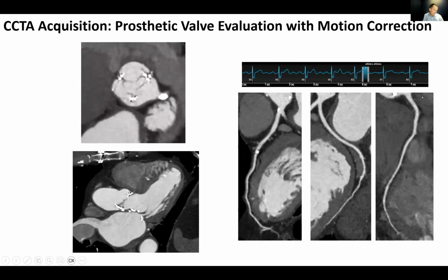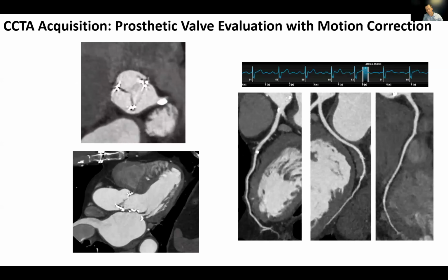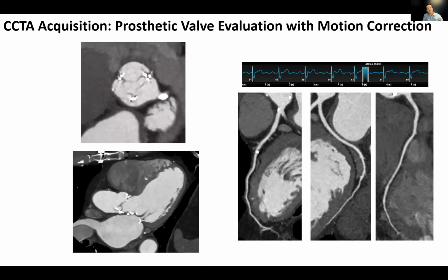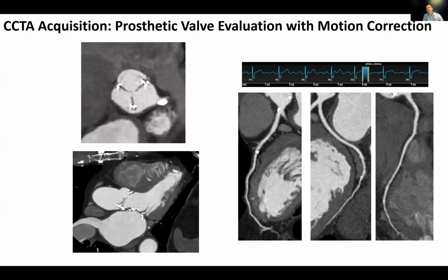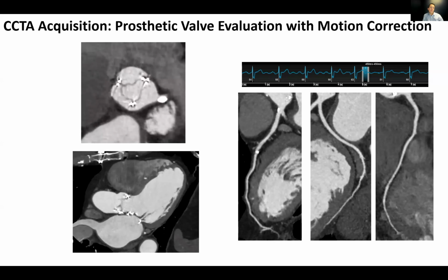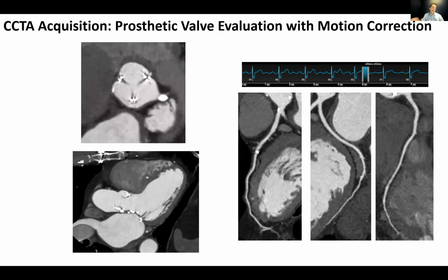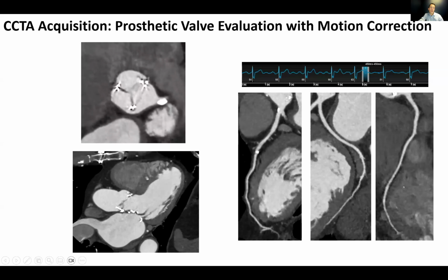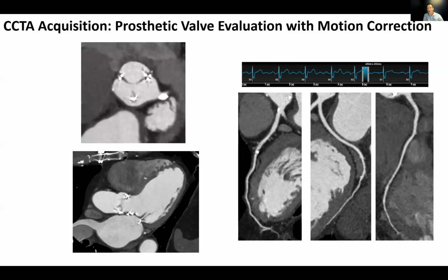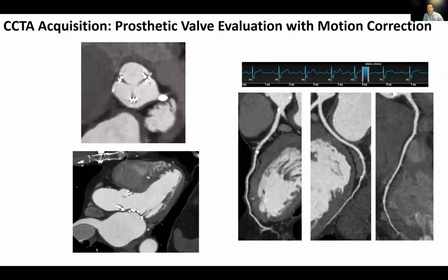This was another patient, and cardiac CT, as it grows and as your site grows, you'll have other indications. You'll step away from coronary CTAs, or you'll add other tests onto it. And this was a patient actually referred for a mitral valve TMVR, transcatheter mitral valve replacement evaluation. But with the large volume acquisition, with motion-free imaging, we're actually able to see that mitral valve. You can see it's severely stenosed. It's not opening well at all, but we're able to get a good look at the prosthetic aortic valve this patient has. And we're able to exclude any issues with that valve.